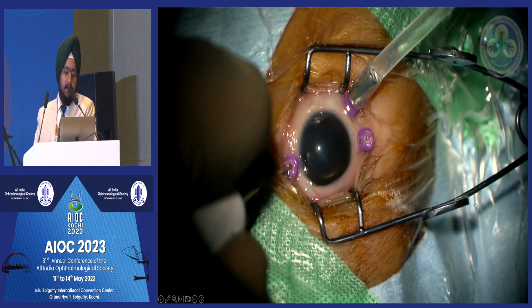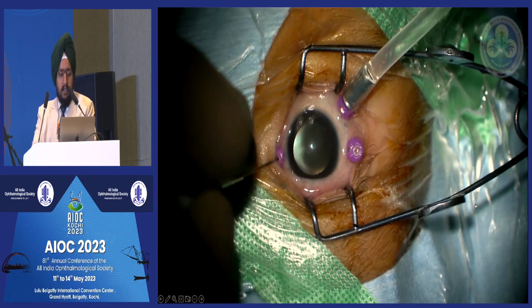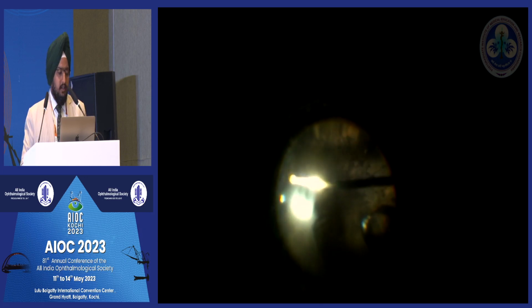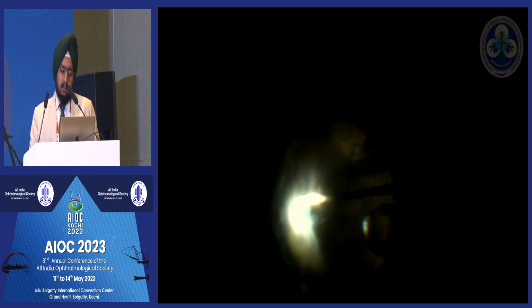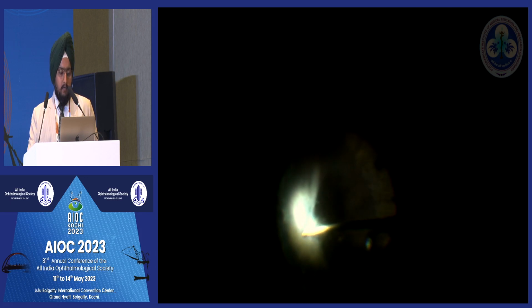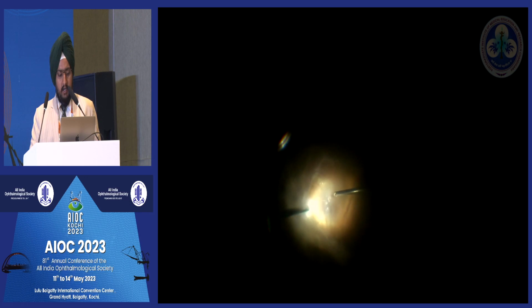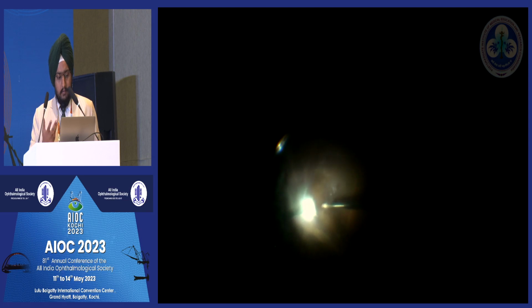Then came on to the other eye. We thought, okay, the better eye, we had a complication, let's hope the other eye goes well. Again, you can see this is more contracted retina together and more lifted towards the crystalline lens. A little more careful about the cutter position this time. Again, dissecting the plane between the lifted retina and the crystalline lens. So that went on well. You keep your cutter position kind of tilted at 90 degrees to dissect that, and then dissecting between the ridge and the periphery. And after that, I went on to the posterior pole to debulk the vitreous over there.